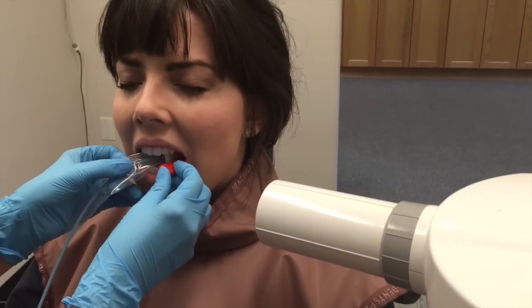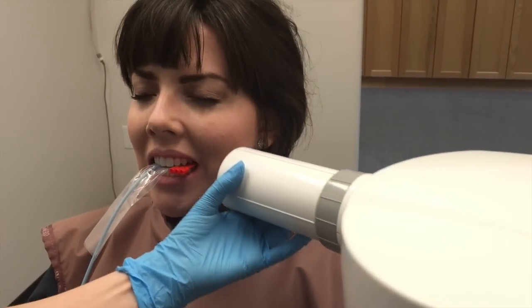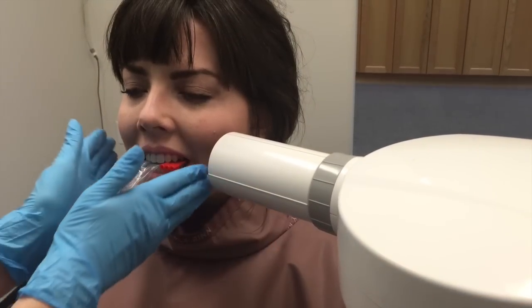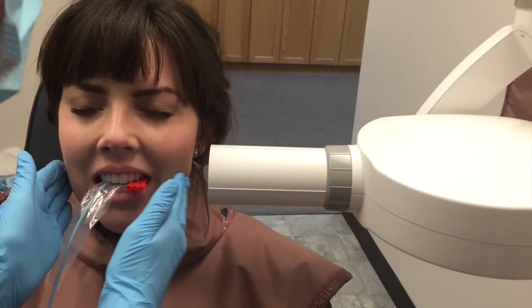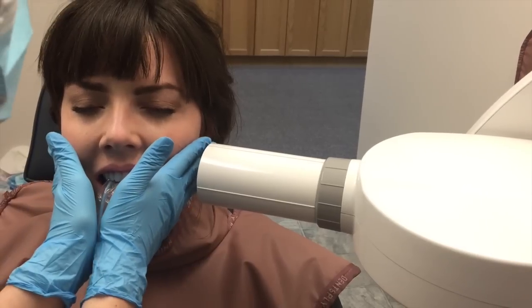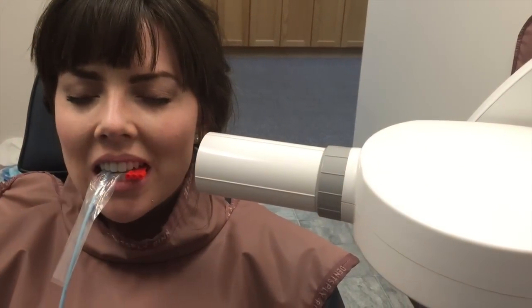Come back and push it back to the molar shot. As she closes, push it back a little bit farther to get the distal of the second molar. Line up the center of the PID with the edge of her eye. To get your horizontal angulation correct — if you have too much gap, you're going to have overlap. Always turn it in to have it perpendicular with the patient's face, then expose the radiograph.